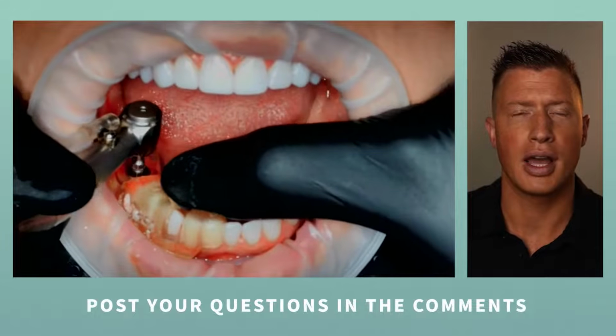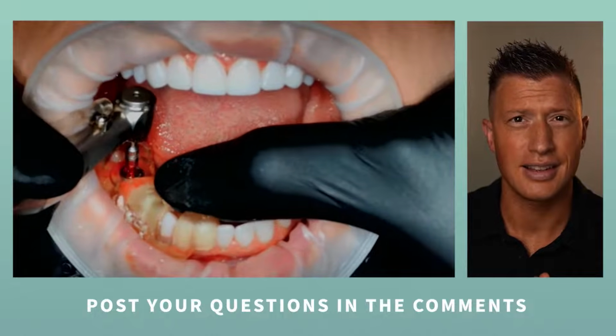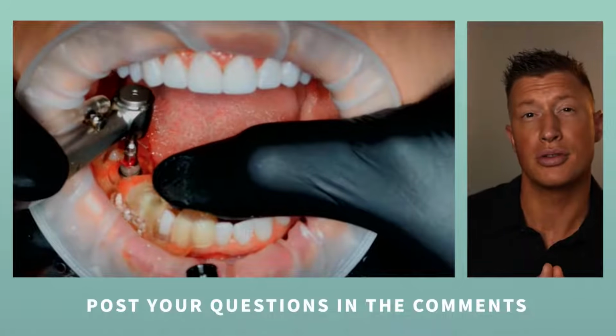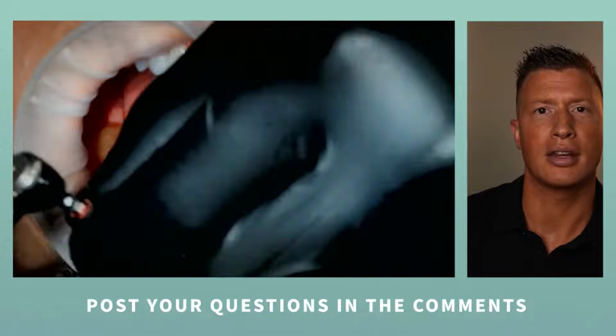And so what you're seeing me right now do is the osteotomy is a judgment on size and how much space we need. I made the osteotomy just a little too small, right? Which is fine. I'd rather be smaller than too large because I can always make it larger. So I backed out the implant. It goes right back into the sterile connection.